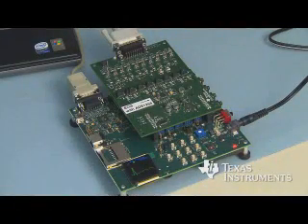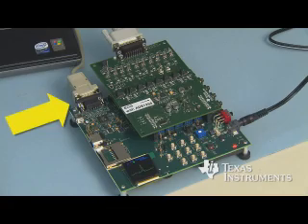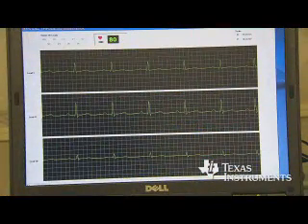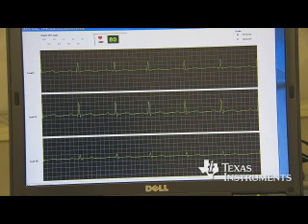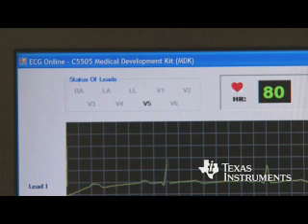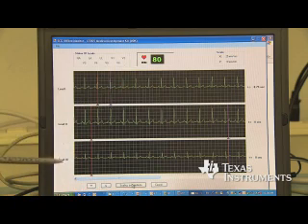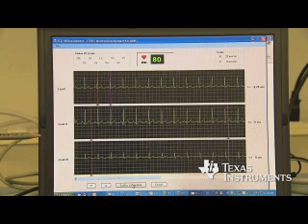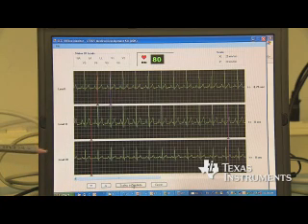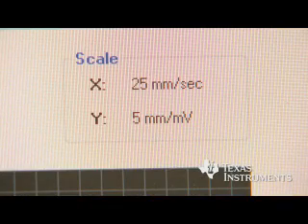A PC application is also included in the demo. The processed ECG data can be sent to a PC from the DSP board via the UART interface. The PC application has the capability to display ECG signals from three leads at a time, and the user can cycle through different leads. It also includes the capability to capture and store ECG data on the computer, playback captured ECG data, and zoom in and zoom out of the ECG signal displayed.